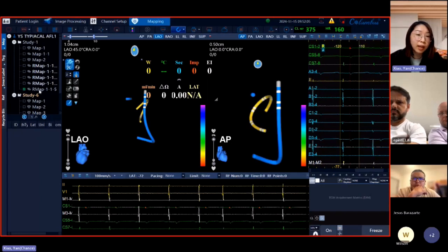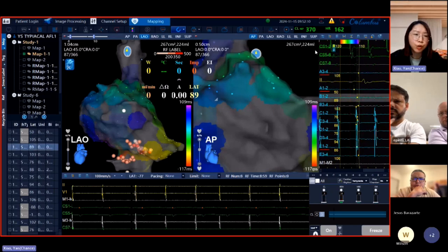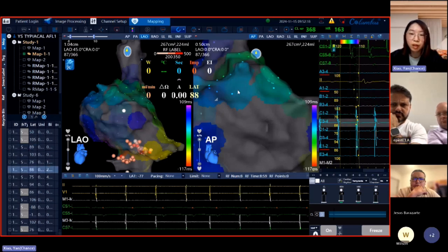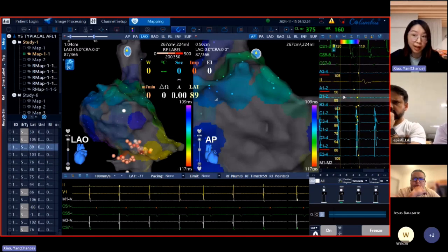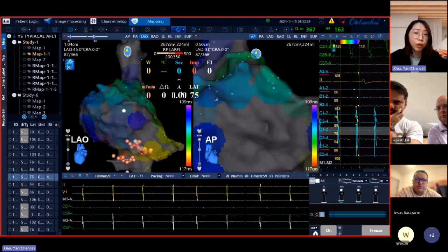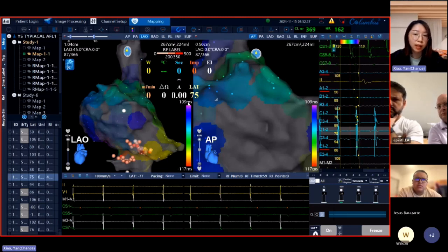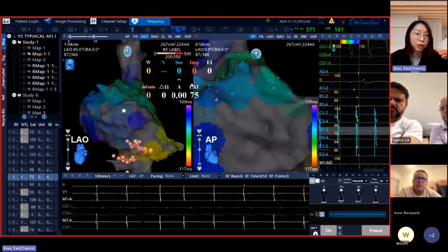And for the signal review, I'll show you. No matter whether you use EasyStar collecting points or use the ablation catheter collecting points, when you review the channel, you will see the value displayed here is the same value as the channel we selected. So it's a new feature for us to use, especially for PVC cases. If the doctor wants to see the large value, just show it to him.